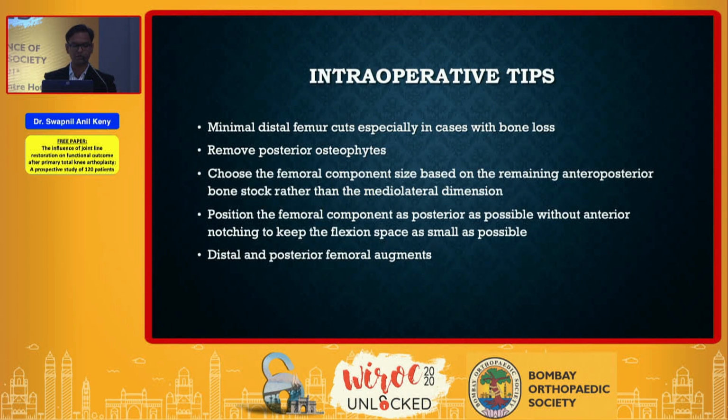Certain intraoperative tips include removing a lesser amount of femur, especially in cases of bone loss, and removing posterior osteophytes so that they do not tent the posterior capsule and reduce the flexion gap. Appropriate position of the femoral component and use of distal and posterior femoral augments, especially in cases with bone loss, should be encouraged so as to restore the joint line as optimally as possible.